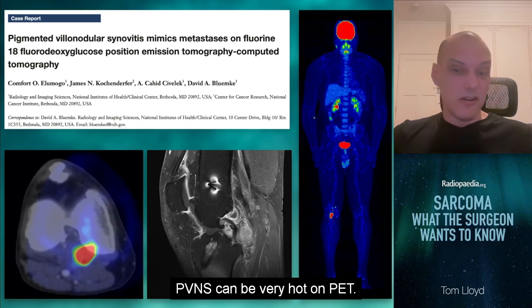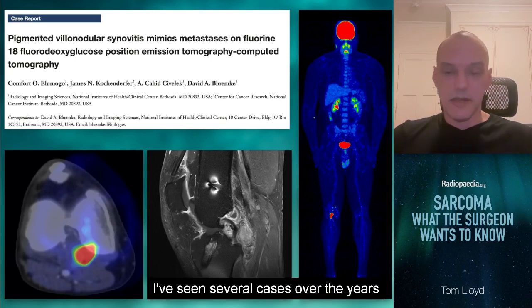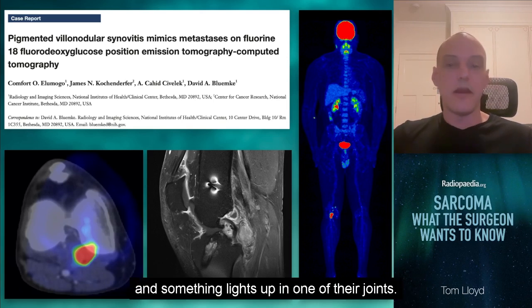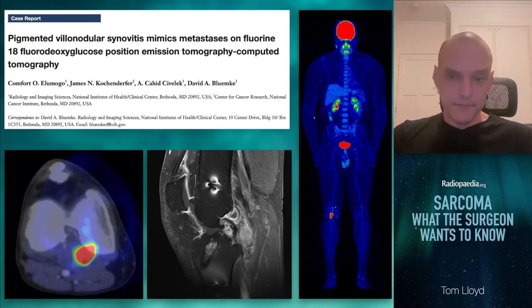PVNS can be very hot on PET. I've seen several cases over the years where somebody has a PET to stage something else and something lights up in one of their joints.